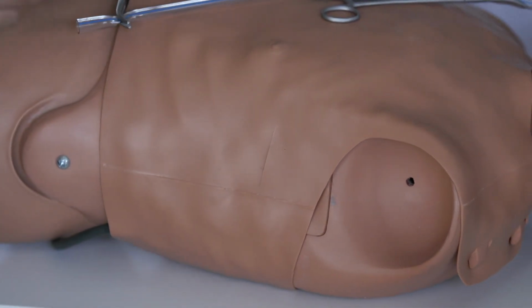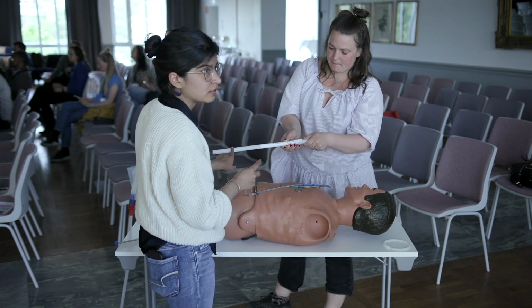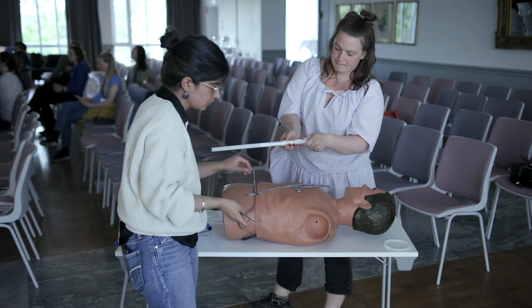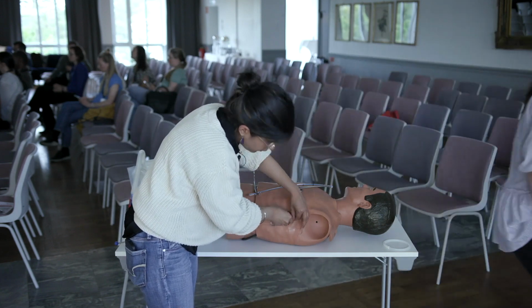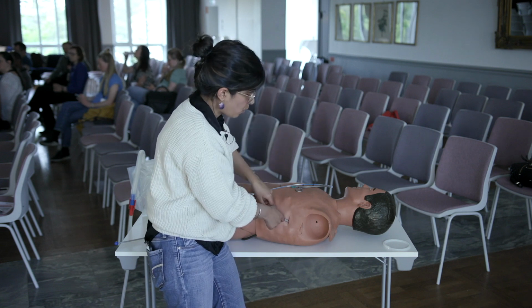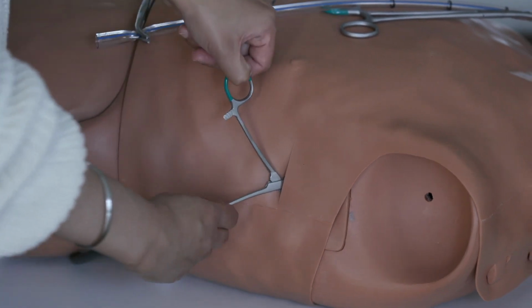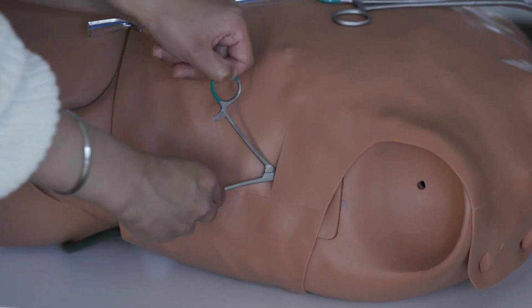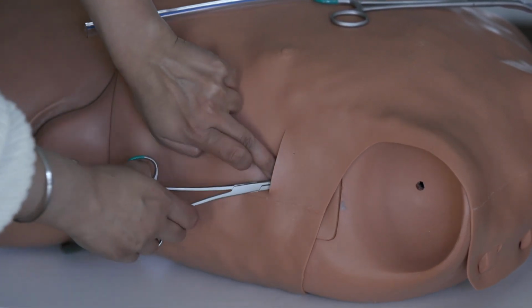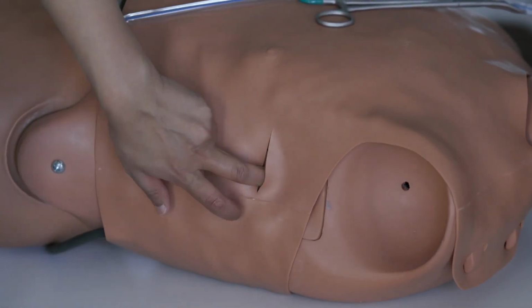So if this is your rib space and you're going above, I position my finger here, and that's my guide for where I need to pop in with my Kelly. Okay, thank you. So now you've popped in with your Kelly, and you'll feel the pop of the pleura, right? Once you're there, you can take your finger out, and then open up your clamp to really open up that pleura. Before I take my Kelly out, I replace it with my finger.